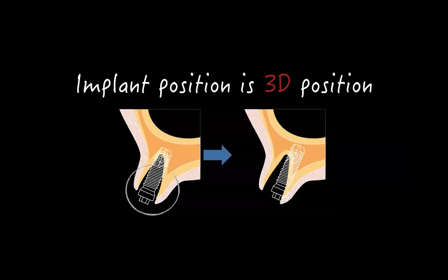Take a look at the picture to the left. That would be you placing an implant on a central area where the apex of the tooth is. Versus the correct location of the implant is the image to your right side. That will be the correct location. Now, when people tell me it's easier to do it because they end up on the criteria on the left side, that's what they end up placing their implant in.